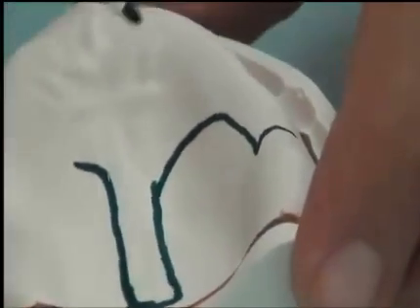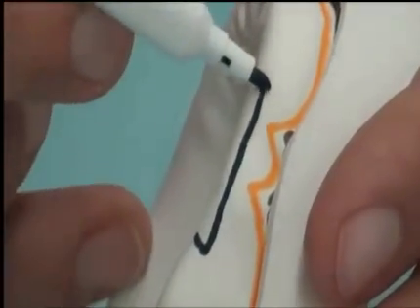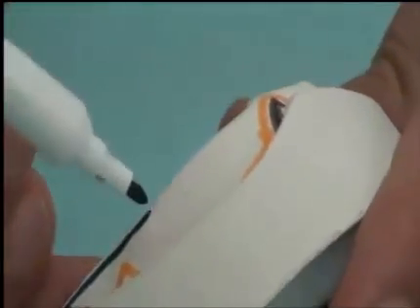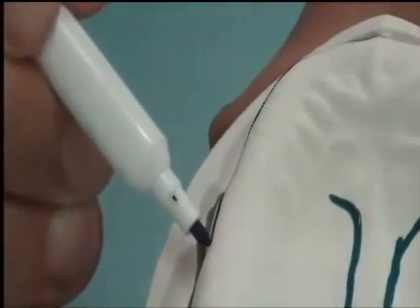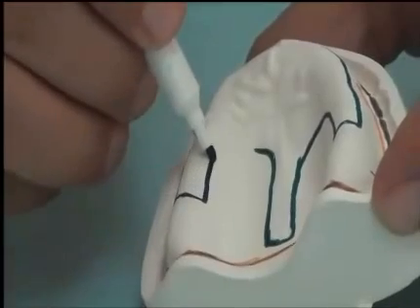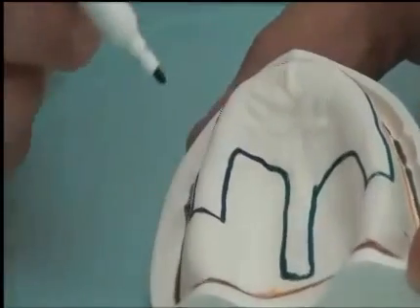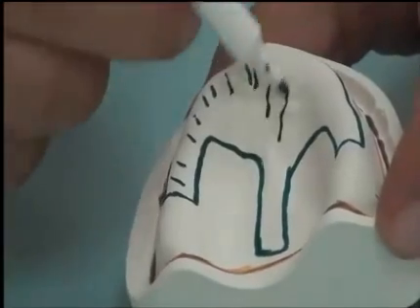We exclude the tuberosity. The crest of the ridge, so it's over and away from the tray border. So the crest of the ridge, the incisive area, the rugae area are included inside these lines. We go all the way to the other side, exclude the tuberosity, and this is our relief area.